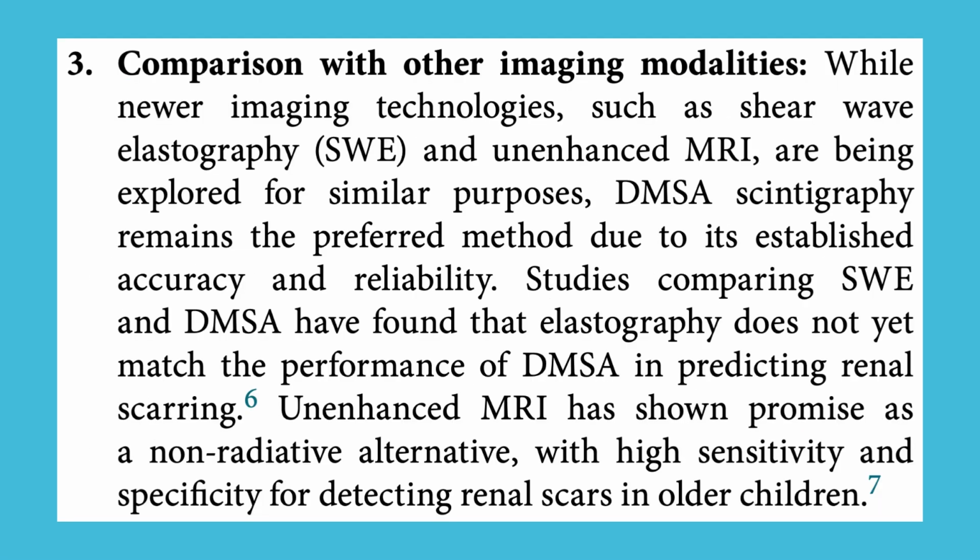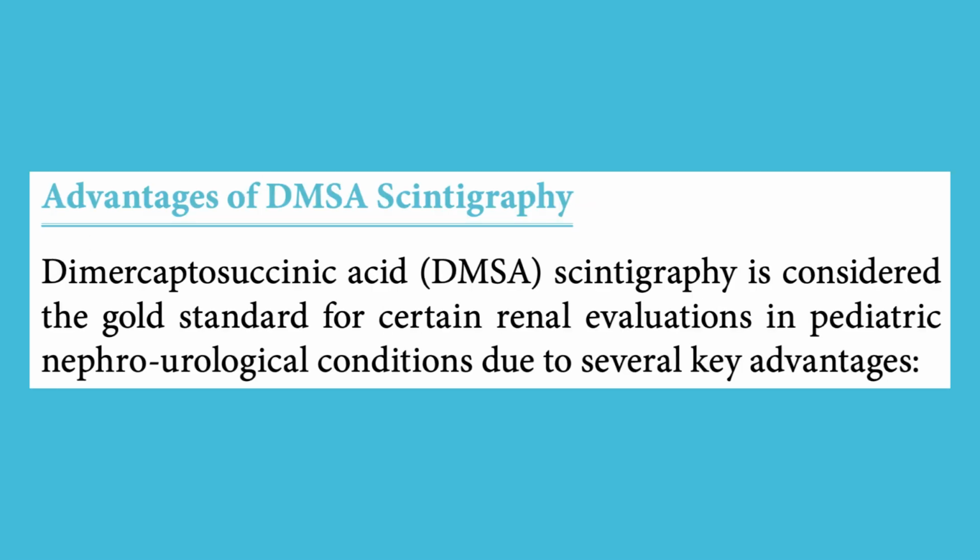3. Comparison with other imaging modalities. While newer imaging technologies such as shear-wave elastography, SWE, and unenhanced MRI are being explored for similar purposes, DMSA scintigraphy remains the preferred method due to its established accuracy and reliability. Studies comparing SWE and DMSA have found that elastography does not yet match the performance of DMSA in predicting renal scarring. Unenhanced MRI has shown promise as a non-radiative alternative, with high sensitivity and specificity for detecting renal scars in older children.